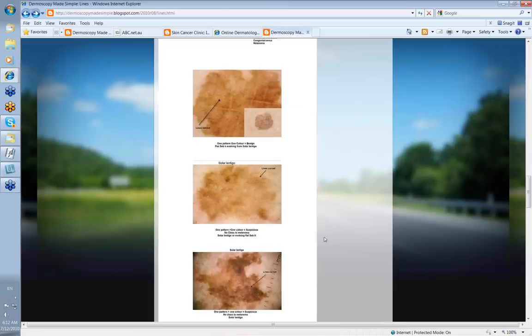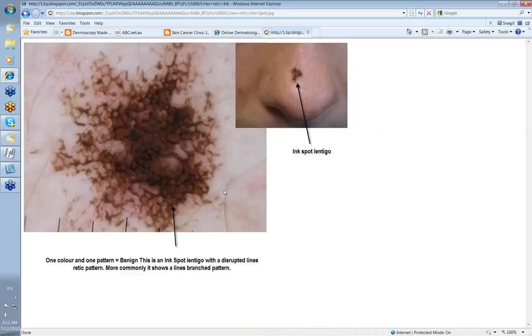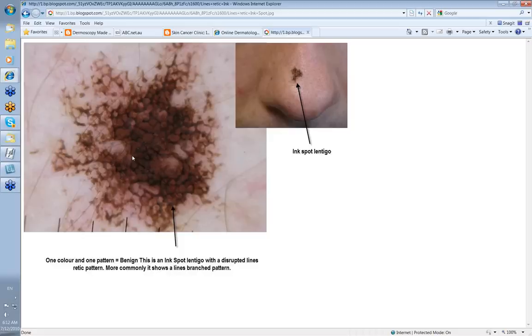Lastly for lines reticular, let's look at this lesion — an ink spot lentigo. It looks like lines reticular, but it's very disrupted; look how broken they all are, like sharp bits of wire at the periphery. Very disrupted lines reticular, very dark color, big difference in the sizes of the holes. But it's still one color and one pattern, so it's benign. More commonly, a solar lentigo or ink spot lentigo shows a lines branched pattern, and that will be the next topic we go on to.